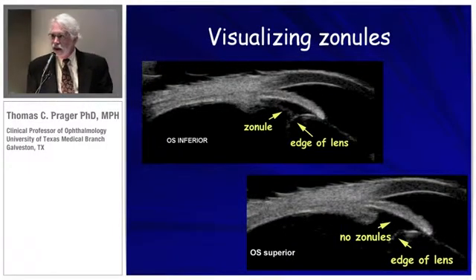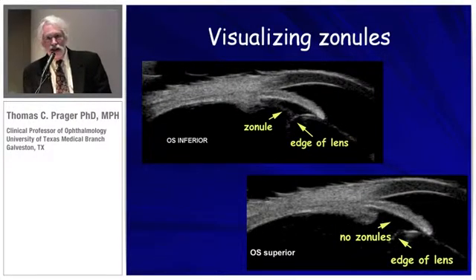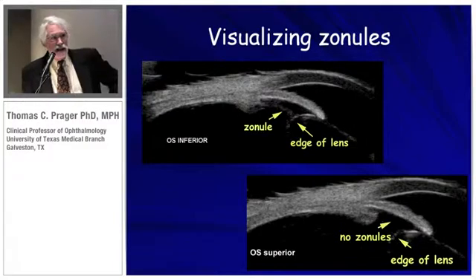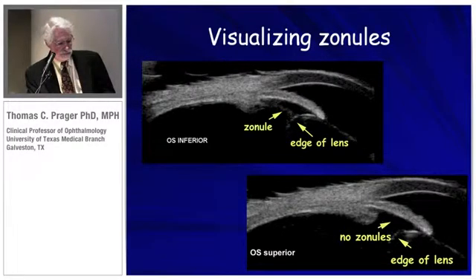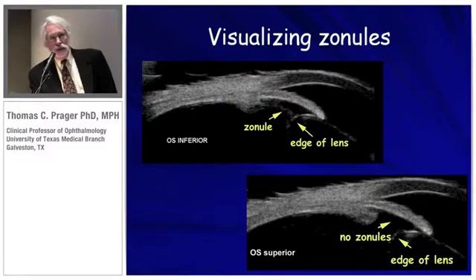Here's an example of the subtleties that can be discerned with a 50 megahertz probe — this is a Quantel. You can see the edge of the lens. This patient presented with lens iridodonesis; it was moving, and the question was: are there broken zonules, or are there zonules present at all? In the top picture, you can see there's a single solitary zonule that is stretched. If the zonule diameter is over one millimeter, we're going to assume that it's stretched.